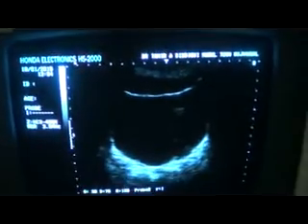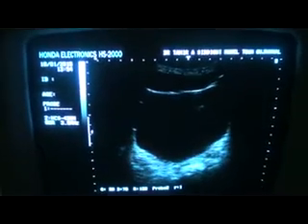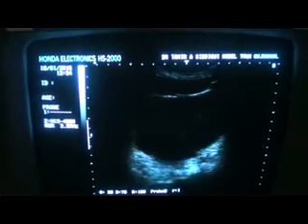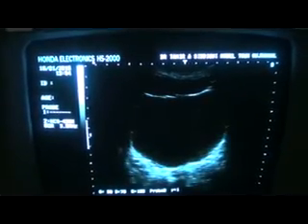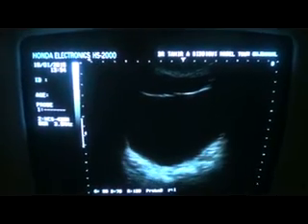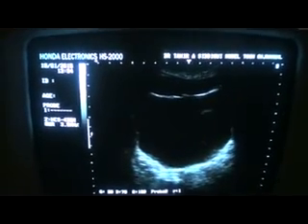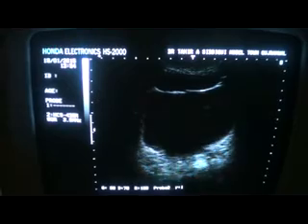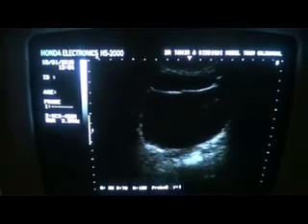Now let's see how we calculate the measurements and the volume of the prostate. I have placed the probe above the suprapubic region. You are seeing all four walls of the urinary bladder in transverse section. I am now going to move the probe inferiorly.